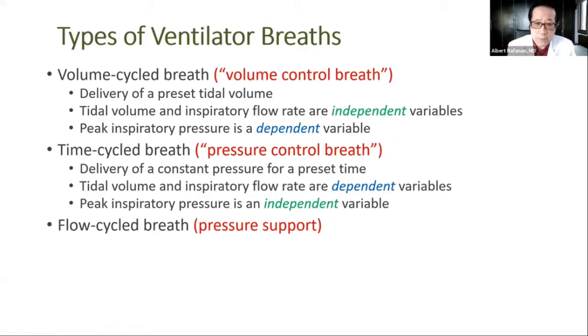Okay, so volume control and pressure control. If you notice, this is Boyle's law. Boyle's law says pressure is inversely proportional to volume, that is, proportional to 1 over volume.